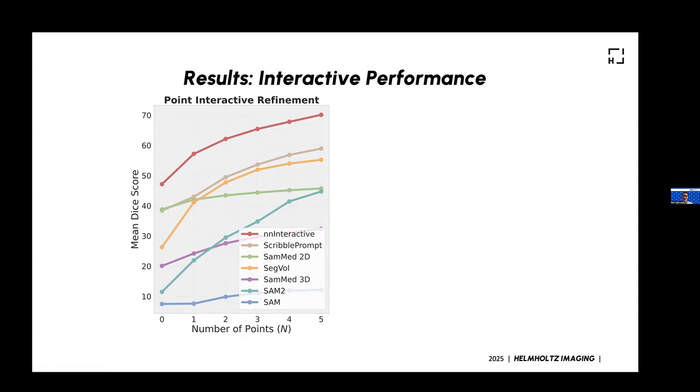But what I want to highlight here, what I found really interesting and also mentioned at the beginning somehow, is that SAM2 is really able to adapt to a new field super quickly. So you have SAM2 here in this turquoise color. It's starting off very badly, but just with a few interactive prompts, it gets the idea really quickly. And no other model shows this capability.